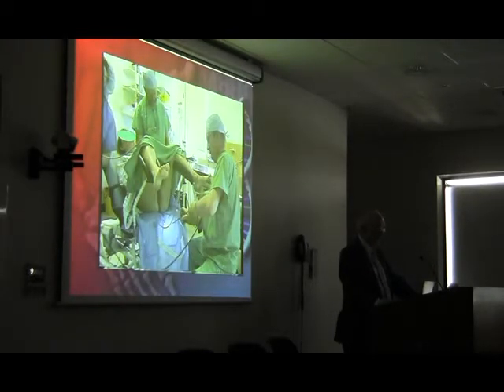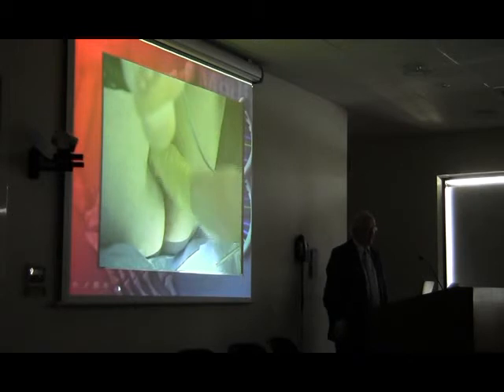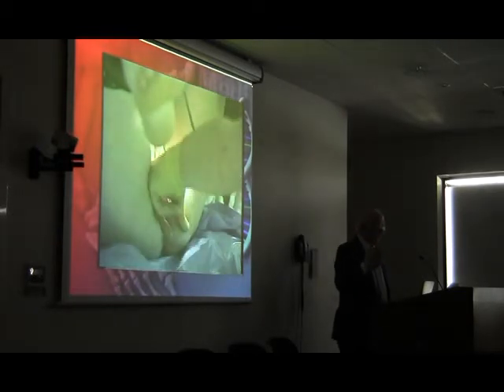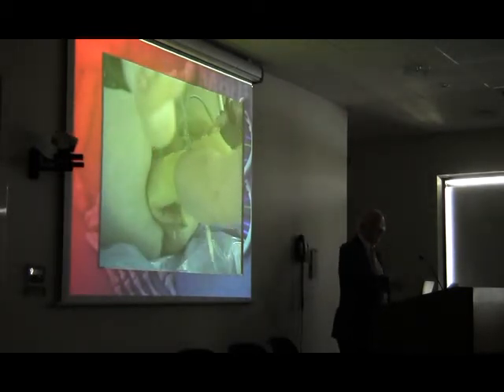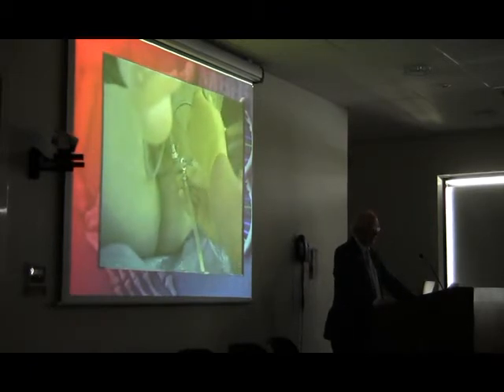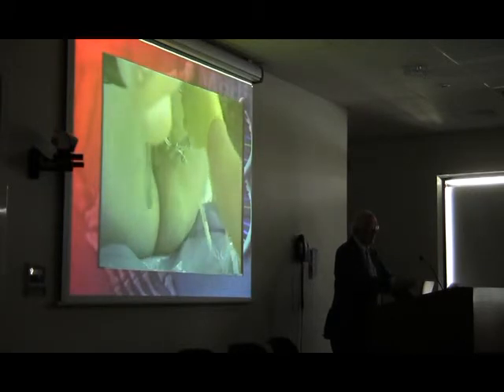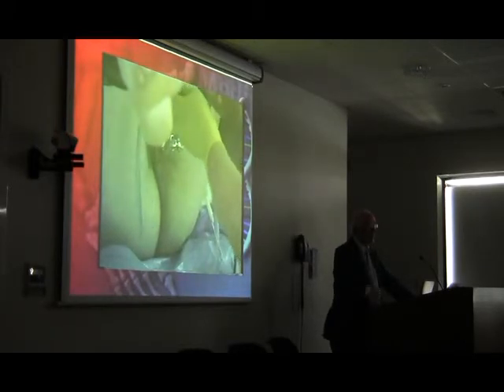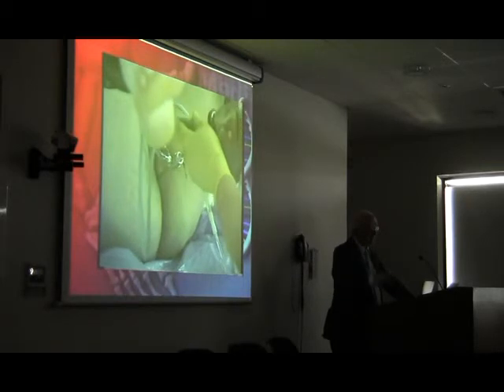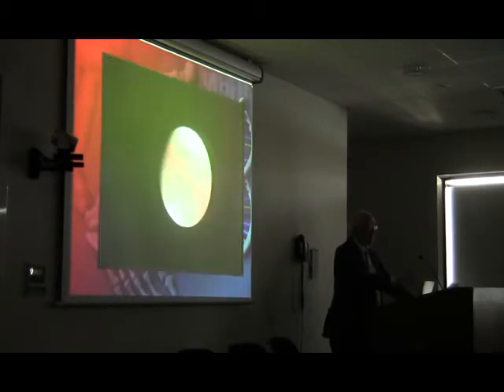Now there's me and Walter in theatre. I thought I'd show this little video of Walter for you. It's going back a bit. But this is just really to show you the scope and the digital exam, as Walter says, to check the cervix. And then there's an inflow and an outflow and a camera on the end. I've got a nice old camera there that's self-righting. They don't make that anymore. But you can see there now where it's going in on the side, so that's going in laterally.